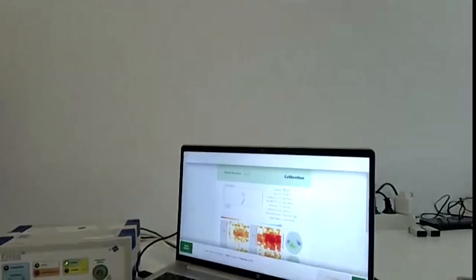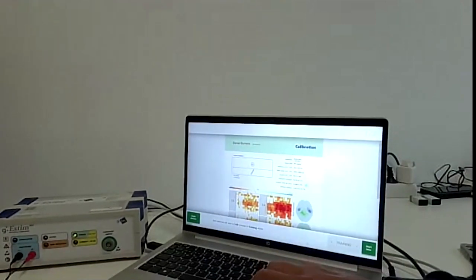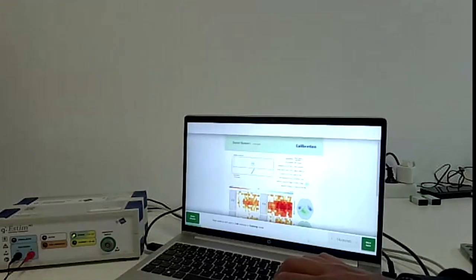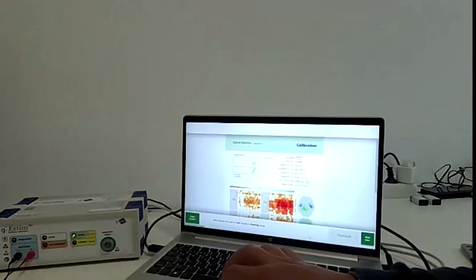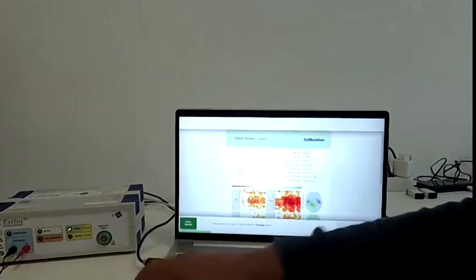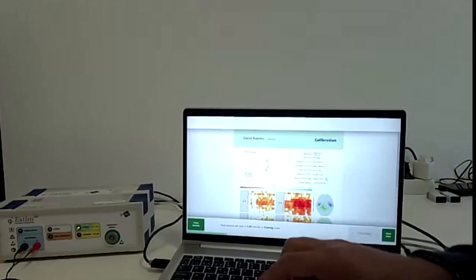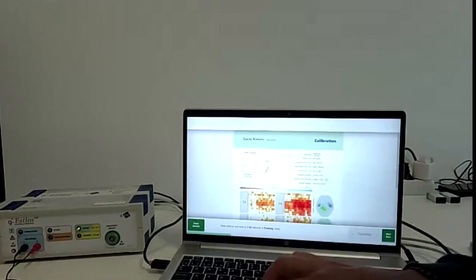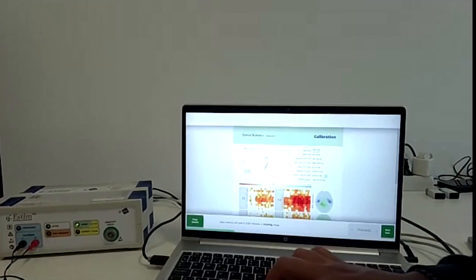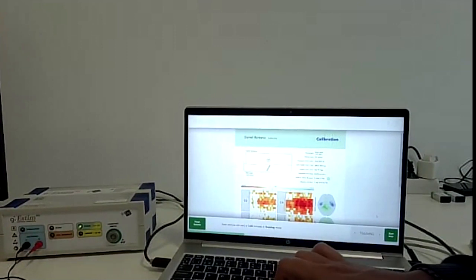So how do you feel, Nani? Fine? Okay. He says now that the stimulation on the left side is too weak, too low, so we have to increase it a bit. In this view that the system is providing us, we can see here the motor imagination accuracy. In this case, it is 64%, which is really low, but it's because I was all the time talking next to him. He said that he was paying attention to what I was saying.